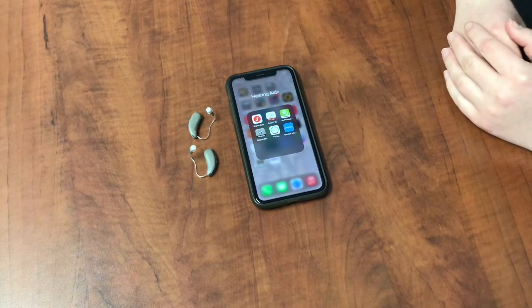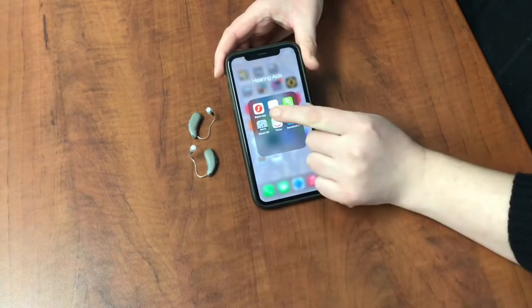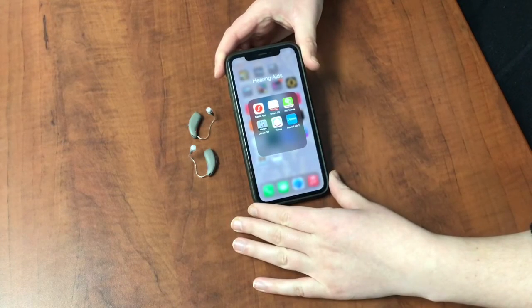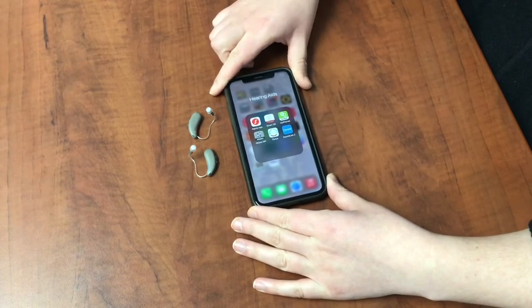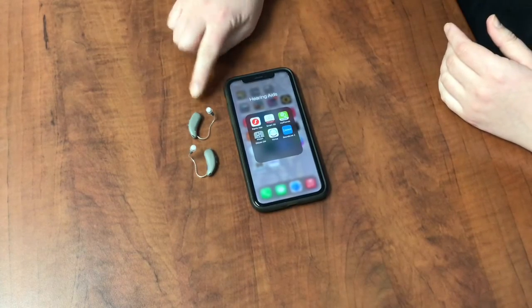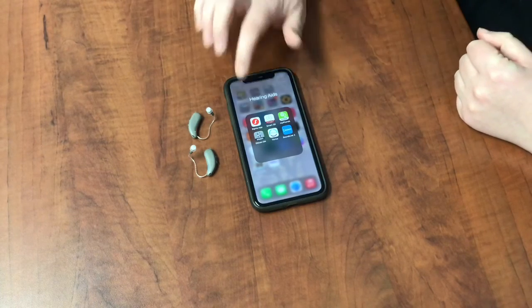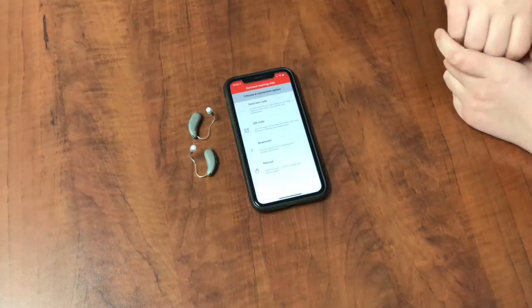To connect your TruHearing or Signia hearing aids to the app, make sure you have the Signia app downloaded to your phone and make sure the hearing aids are already paired to the phone. If you have hearing aids with batteries, make sure those battery doors are closed and go ahead and open the Signia app.